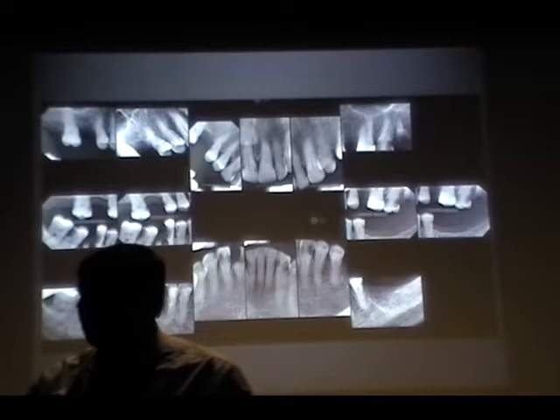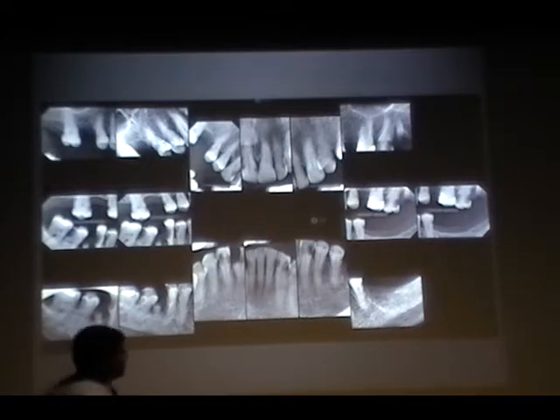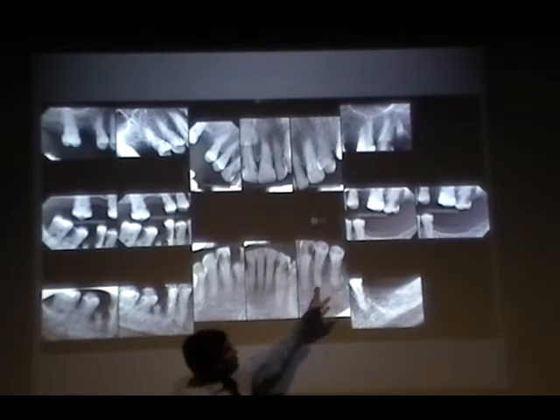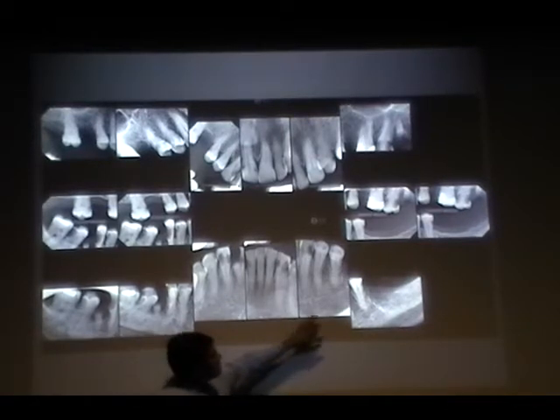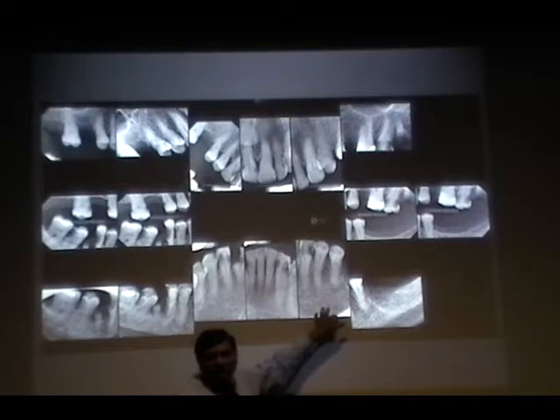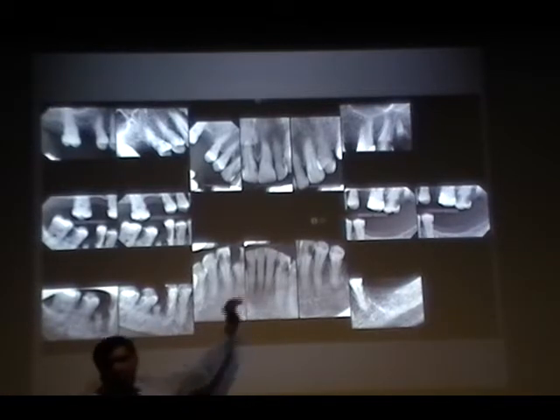The lateral incisor contact with the canine is not open, and you're missing a little bit of the surface, the occlusal surface of the lateral incisor. So, if you look, or you may have observed that most of the problems are in this region, right? Lateral incisor region. The ones that I explained. So try not to repeat those mistakes. Moving on. Your name, please. Well, maybe next time. Okay.